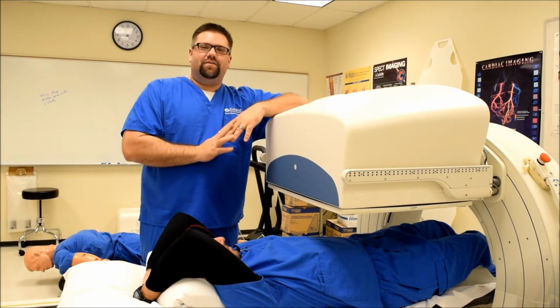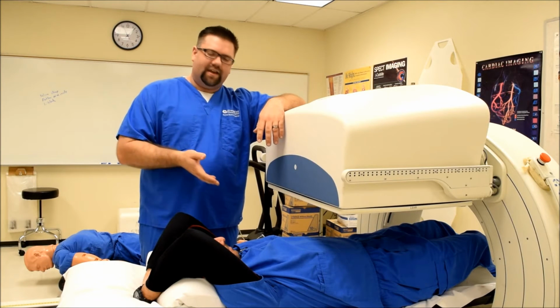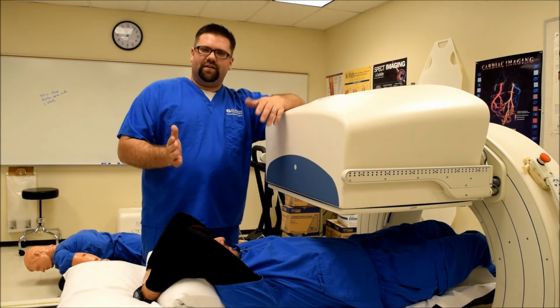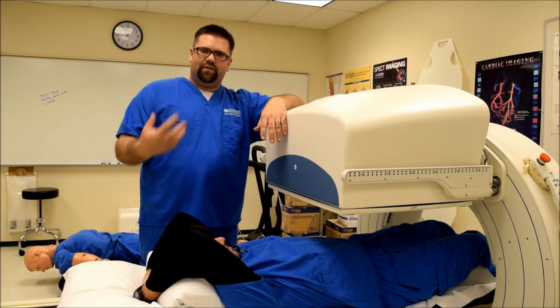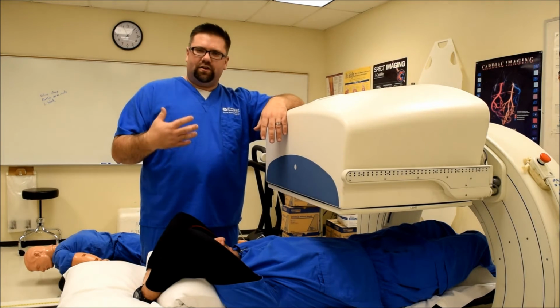For a SPECT bone scan, you're going to bring the patient in and we're going to do the area of interest. In this case, we're imaging the lower spine and pelvic region. You'll take them in so everything's in your field of view. It'll show up nice and bright on your bone scan because the radiotracer that we've given them has already had time to attach itself to the bone. And I'm going to show you another angle.